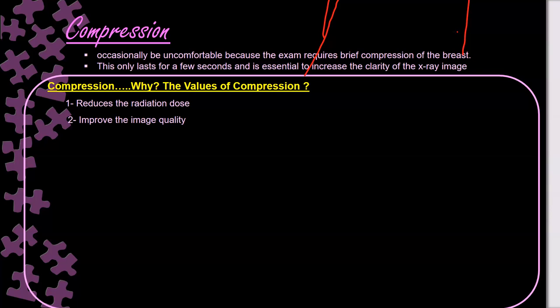Compression has two main values: reduce radiation dose and improve the image quality. That is why from the beginning we have to inform the patients that they are going to be exposed to a brief compression. It is not painful, but it is associated with some discomfort, and it will last for a few seconds. But it is so important to have a good quality image. Just prepare the patient to accept the compression. So it will reduce the radiation dose and improve the image quality.